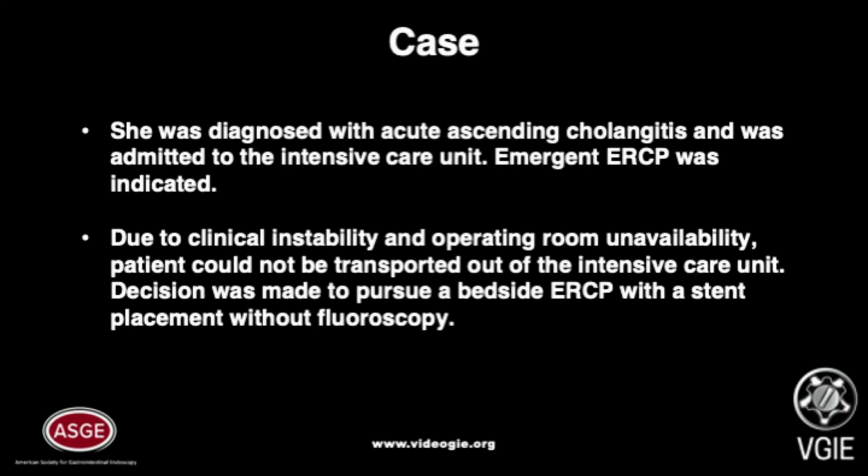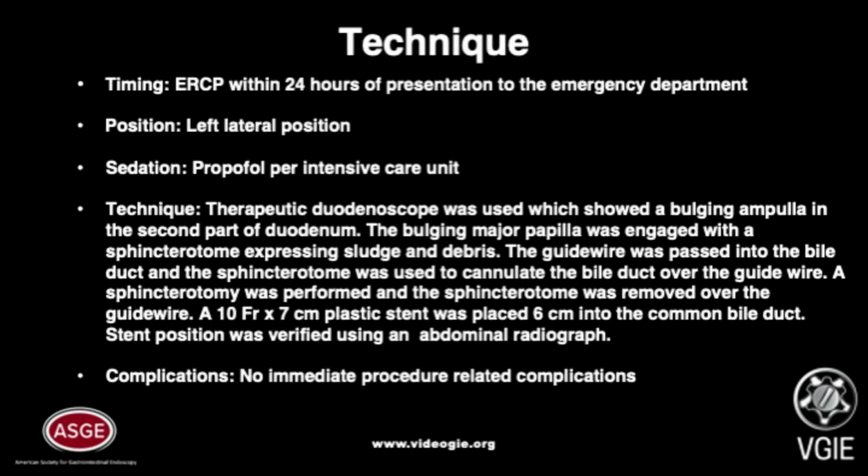Emergent ERCP was indicated. Due to clinical instability and operating room unavailability, the patient could not be transported out of the intensive care unit. The decision was made to pursue a bedside ERCP with stent placement without fluoroscopy. ERCP was performed within 24 hours of presentation to the emergency department.